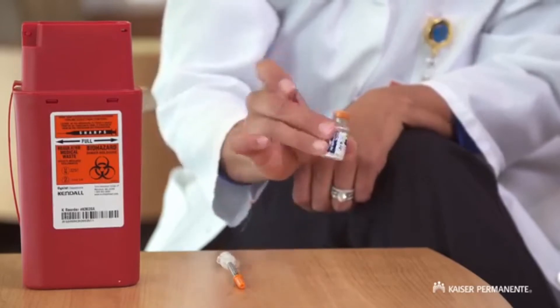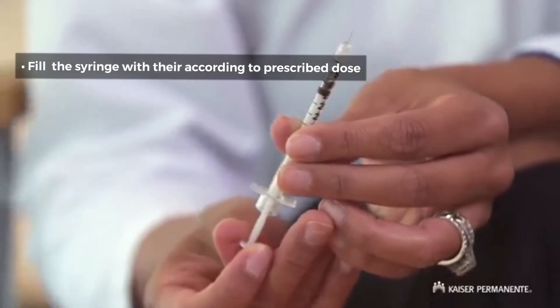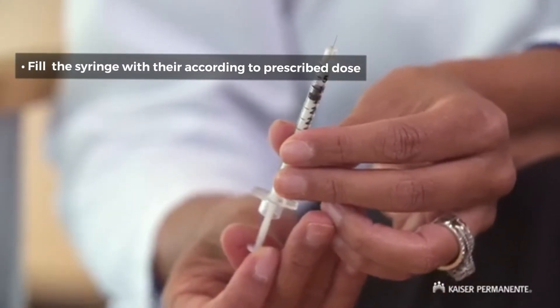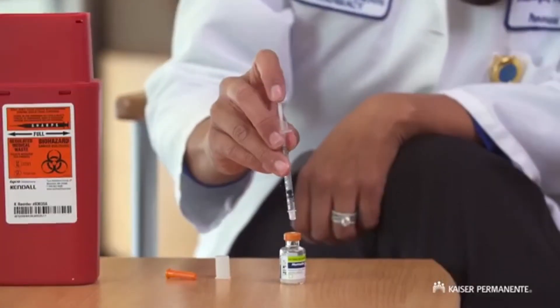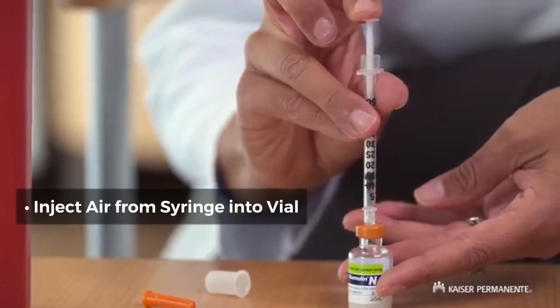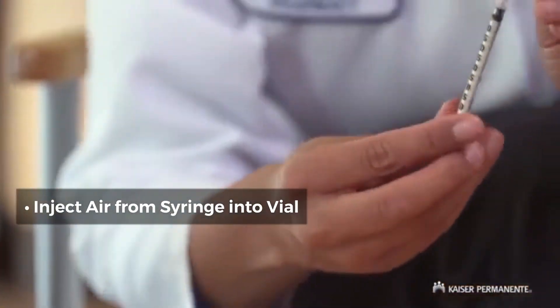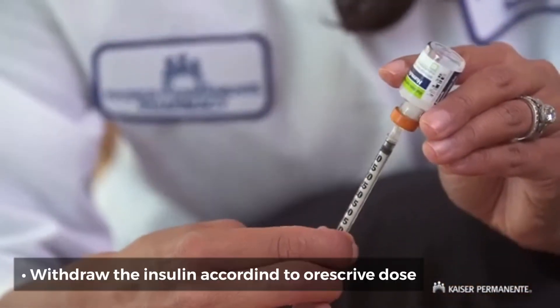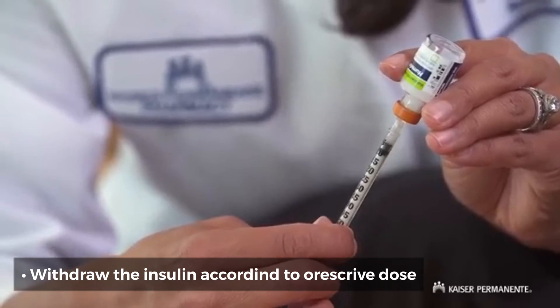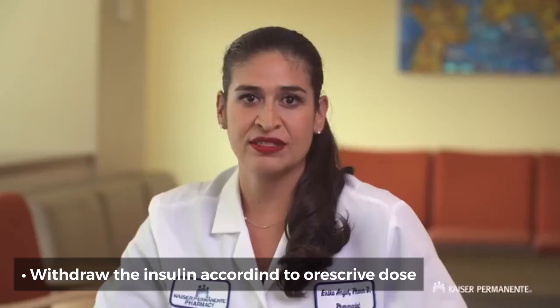When you're ready to inject, pull the plunger back to the number of units needed, drawing air into the syringe. Insert the needle into the bottle of insulin through the rubber cap. Inject the air from the syringe into the bottle. Turn the bottle upside down with the needle in it. Make sure the tip of the needle is fully submerged in the insulin as you pull the plunger back to the correct number of insulin units.